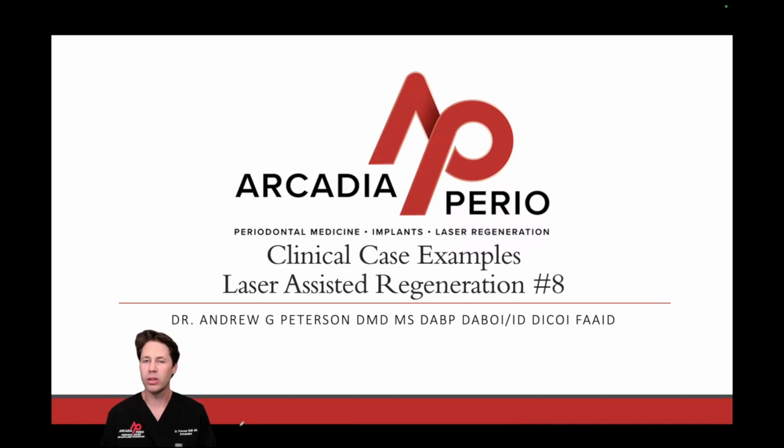Do you struggle with diagnosis and treatment planning with periodontal defects in the anterior aesthetic zone, like I once did? These cases can be demanding and challenging and difficult to maintain good aesthetics post-treatment. What if I told you bone grafting and membrane was no longer the treatment of choice for periodontal defects in the anterior aesthetic zone? Instead, it should be laser assisted regeneration as your number one line of defense for managing these periodontal defects. But don't take my word for it.